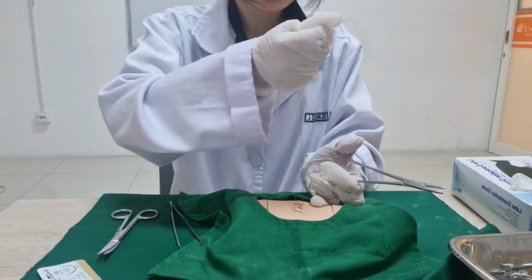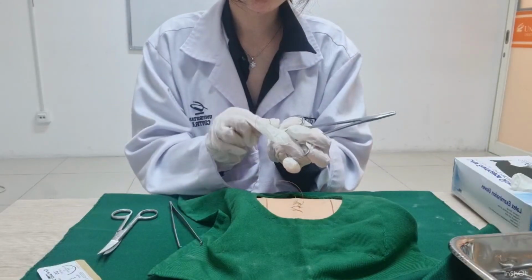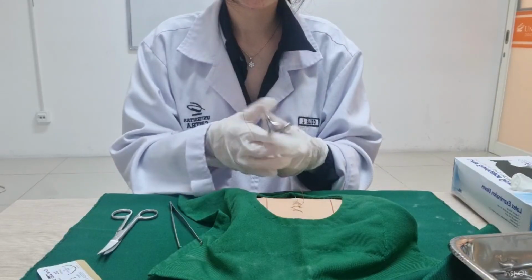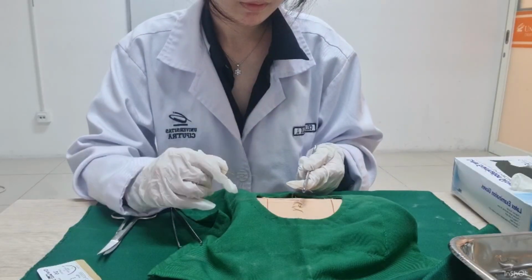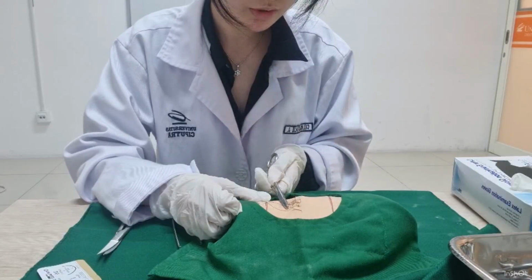Okay. And I will continue again, placing the needle holder at the distal 1/3. Okay, so I will continue without stopping. Make sure that the spacing between the sutures are even.